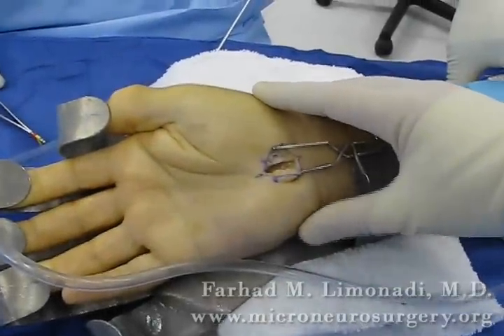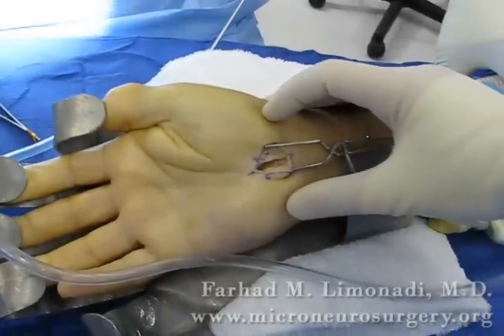This is a mini carpal tunnel release. The incision is approximately an inch.